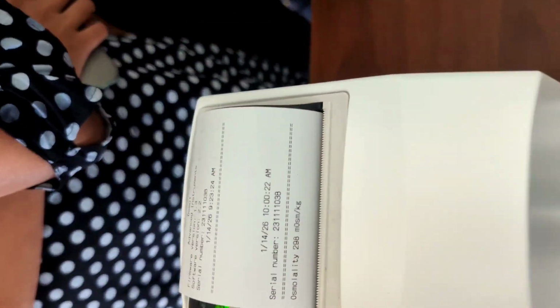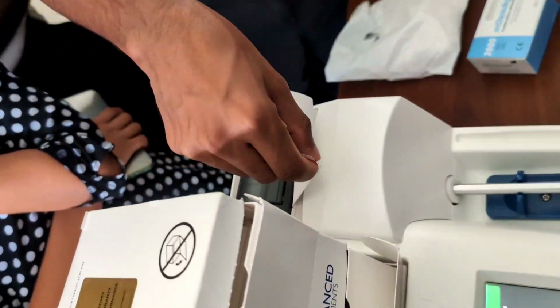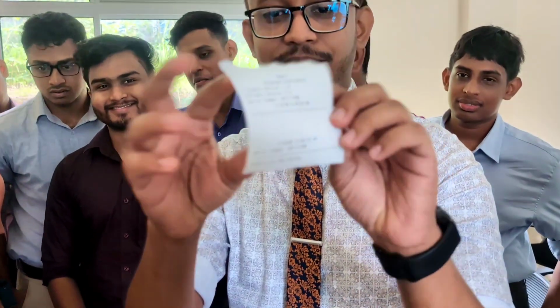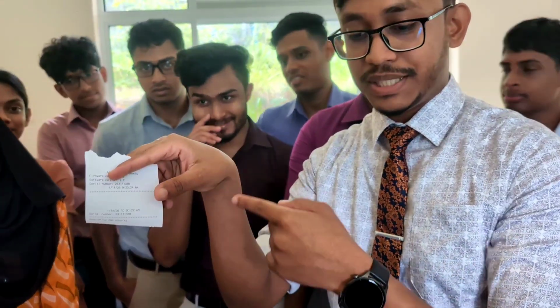Can someone read this? So you get a value like this. There are spaces to enter the patient IDs and other details.